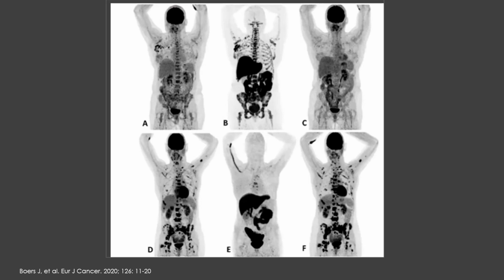As you can see, image B shows the baseline of the FES study and the ER expression in the axial skeleton, including the vertebrae, the pelvic bones, even the humerus and the femur, and in the axillary lymph nodes. After 8 weeks, the patient underwent the FDG study showing almost complete metabolic response to the hormone therapy, and that patient was successfully put on treatment for more than 70 weeks and doing well.